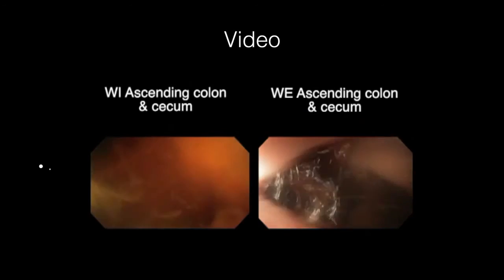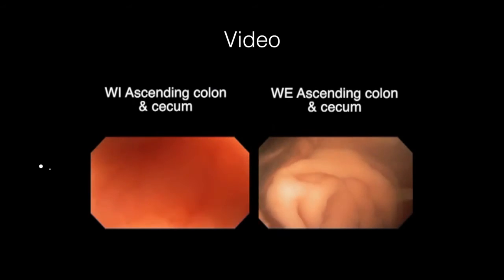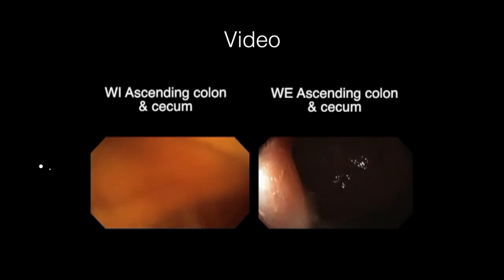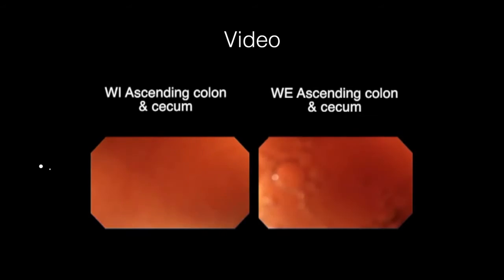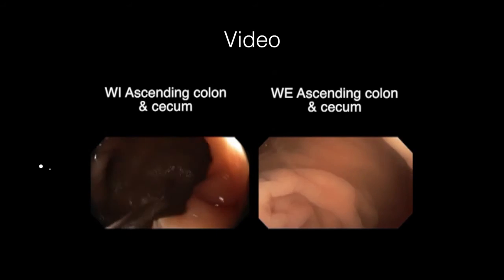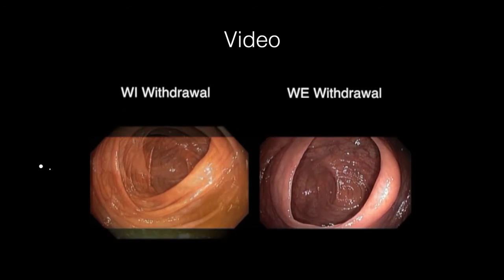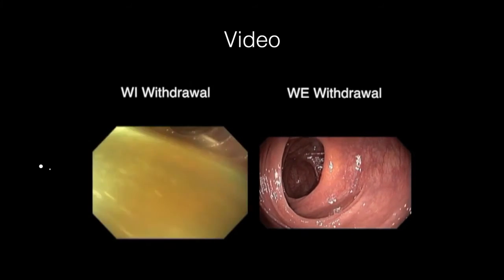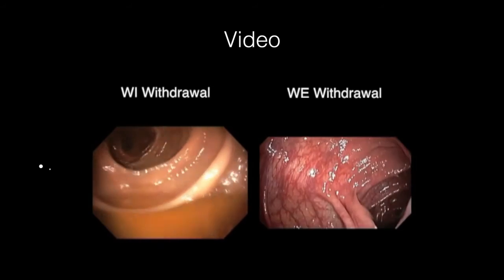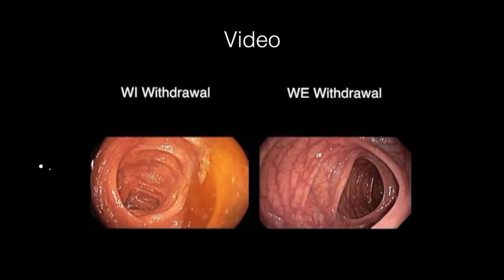Once the cecum is reached, it is thoroughly washed, and then withdrawal in both techniques is carried out using insufflation. You will see the appendiceal landmark on both sides. During withdrawal, in the water immersion technique there is dirty fluid in the colon that has to be aspirated. But on the right-hand side, withdrawal with water exchange shows a very clean bowel. We believe that is the likely reason we pick up more pathology using the water exchange technique in colonoscopy.